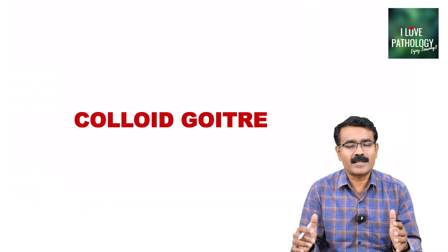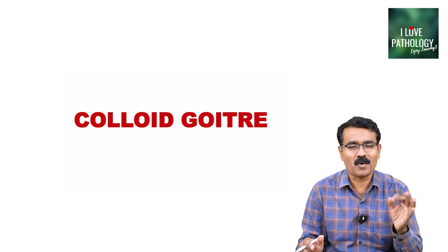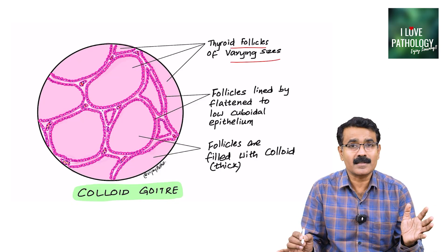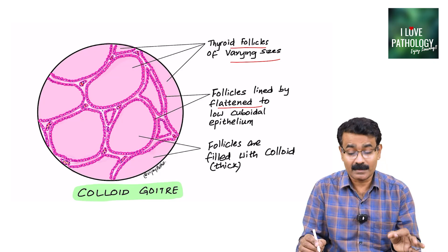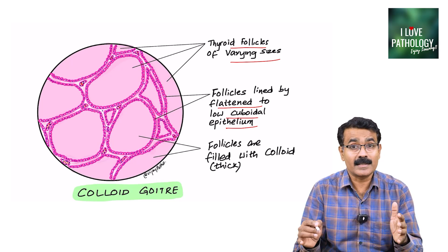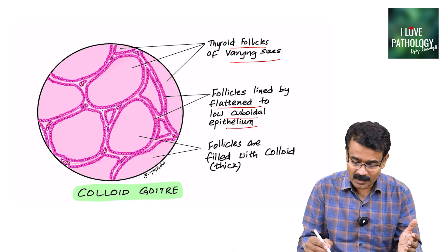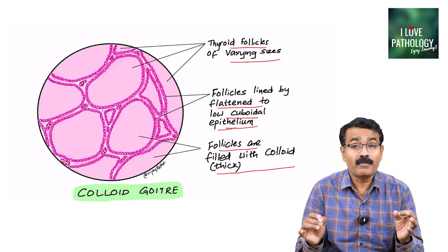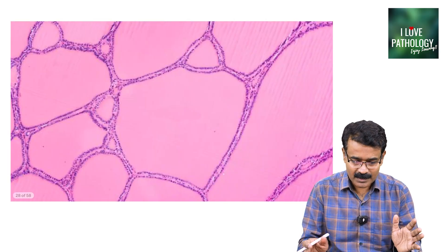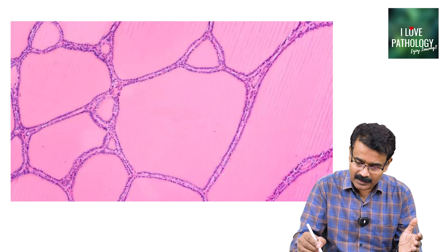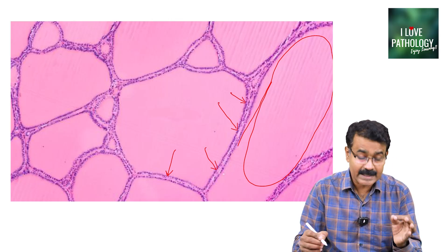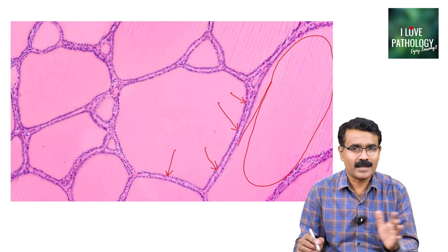Moving on to thyroid pathology, the most common and easiest slide is colloid goiter. All you can see is thyroid follicles of varying sizes, lined by flattened to low cuboidal epithelium — a very characteristic feature. The lumens of the follicles are filled with colloid, which is bright pink in color. Colloid goiter is very simple — variable size follicles filled with colloid, each lined by flattened or low cuboidal epithelium.